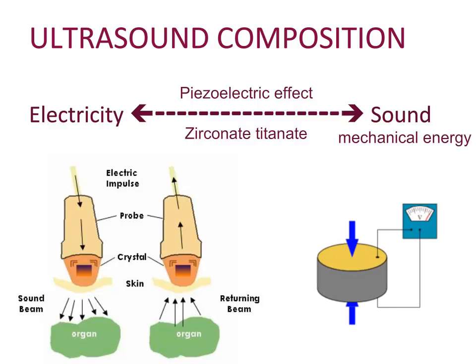When electrical current is applied to the crystal inside the probe, the crystal vibrates, causing an ultrasound wave creation. A backing material, also called the dampening layer, stops the crystals from continuing to vibrate, and a matching layer is positioned in front of the crystal to lower energy loss by minimizing changes in acoustic impedances between connecting surfaces in the path of the ultrasound wave.